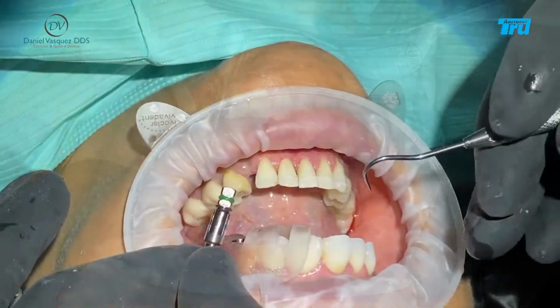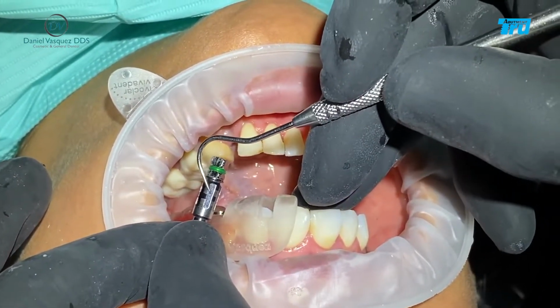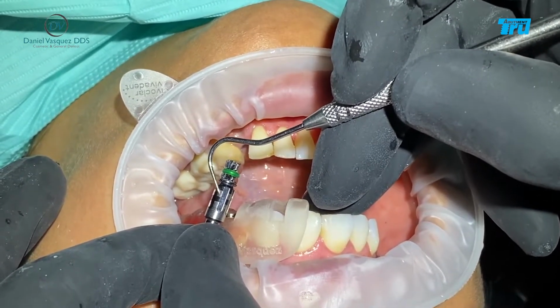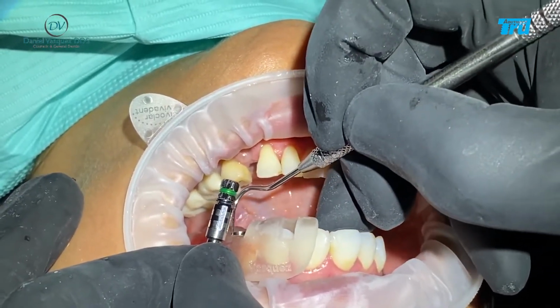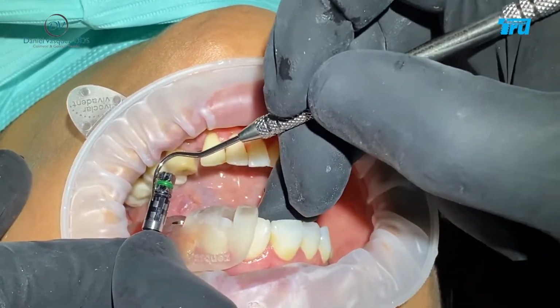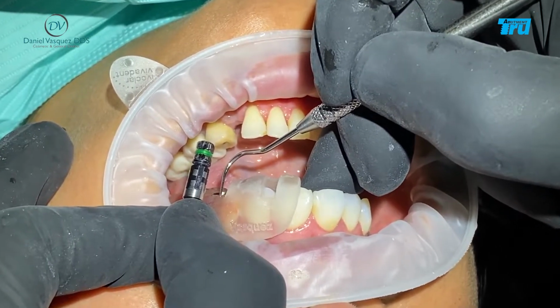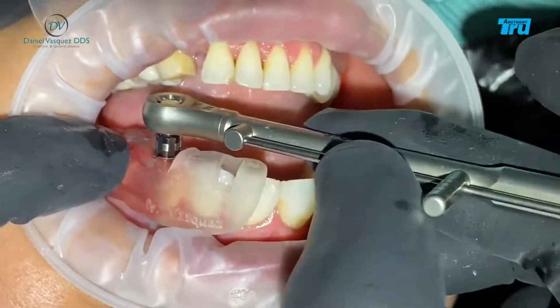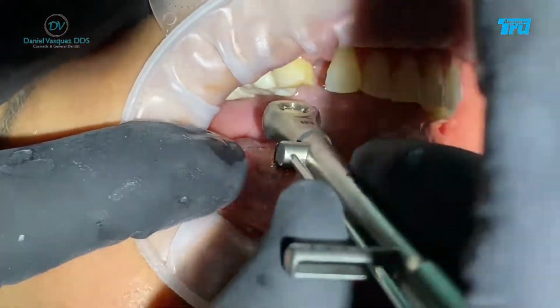Excellent. So our protocol says that the depth of our implant has to be all the way down to this line, to the black line here, or the silver. It needs to go directly where the implant, and those black lines need to fit perfectly into the wings. So you have to go to here to there. So now we're gonna use our wrench for that. Now we're gonna use our wrench, position our place to depth.